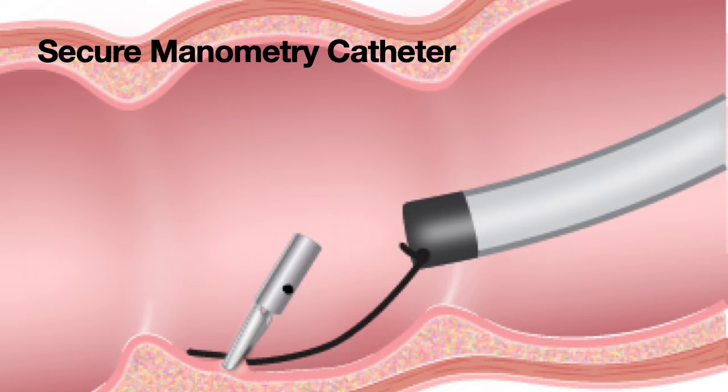People who do research in the colon and want to attach the manometric catheter to the transverse colon or proximal colon have used clips to secure them as well.